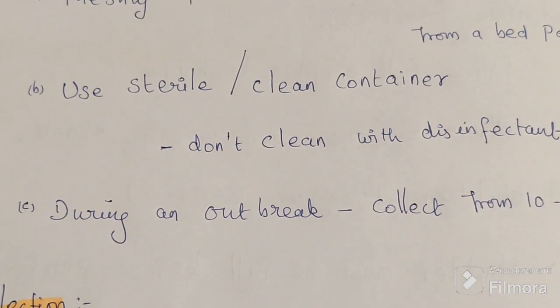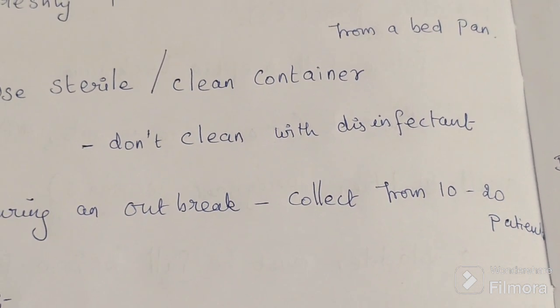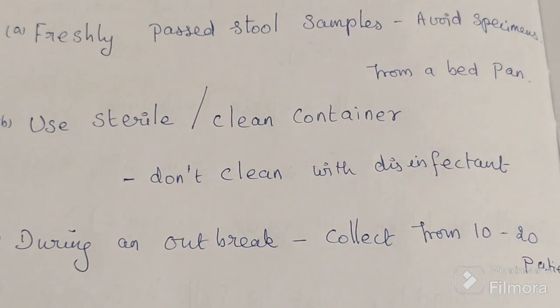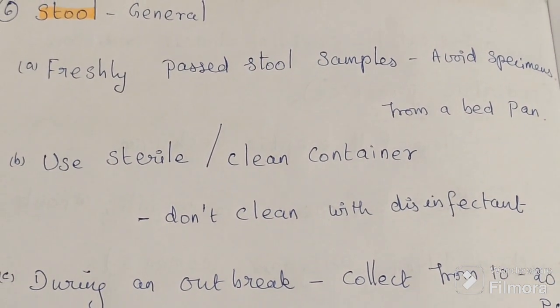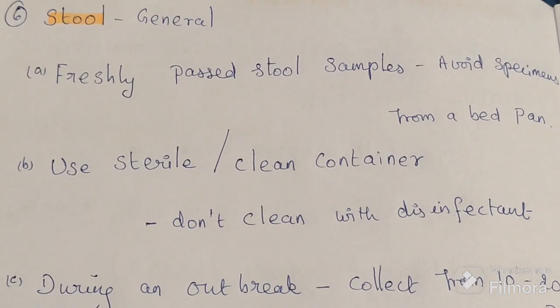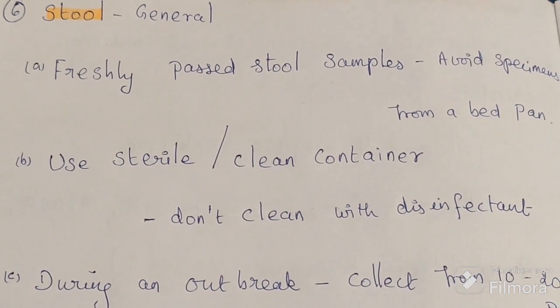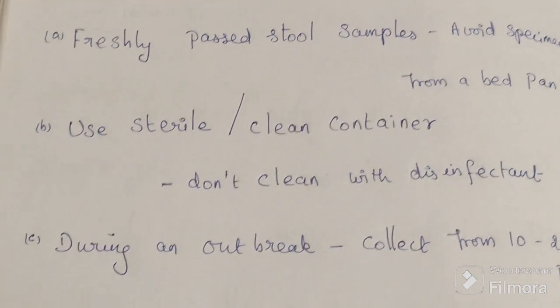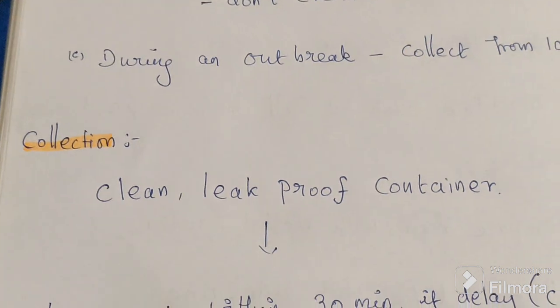During an outbreak, we collect samples from 10 to 20 patients. Freshly passed stool only is required; bedpan stool samples are not recommended. The container should be clean, not cleaned with disinfectant.